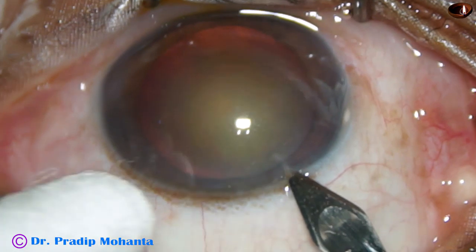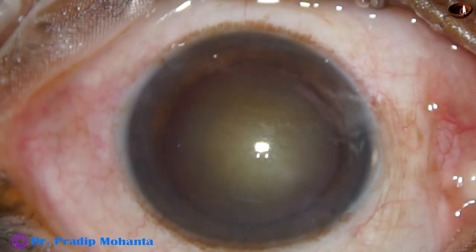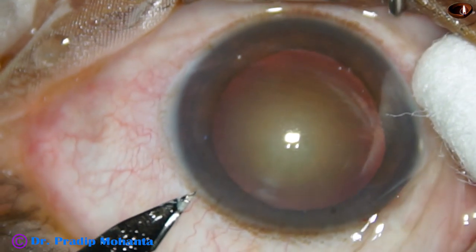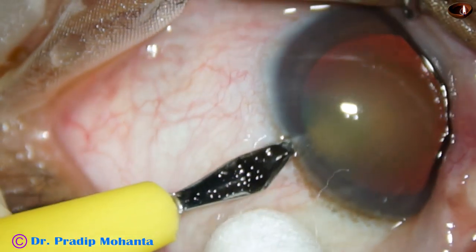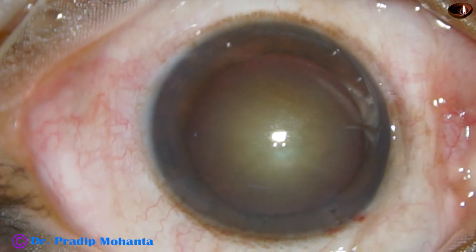Now the main incision is made with a 2.8 mm steel keratome at around 10:30 or 11 o'clock. A side port is made on the left side of the main incision, about 2.5 to 3 clock hours away.